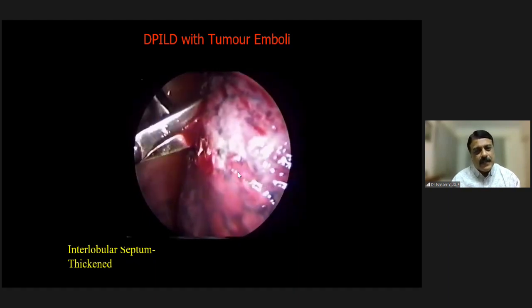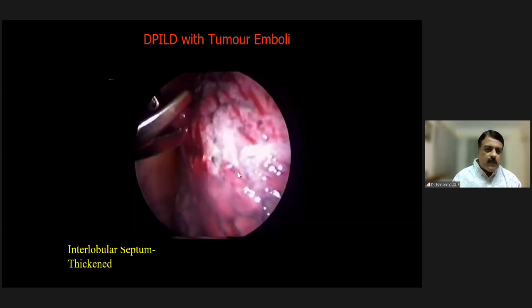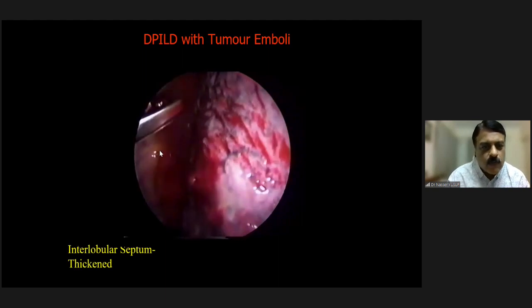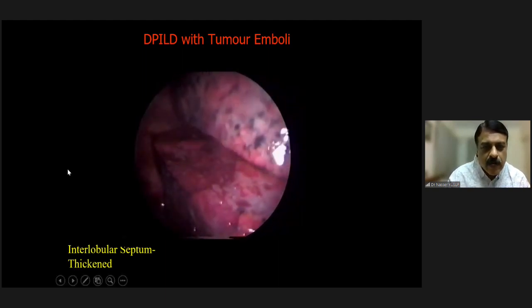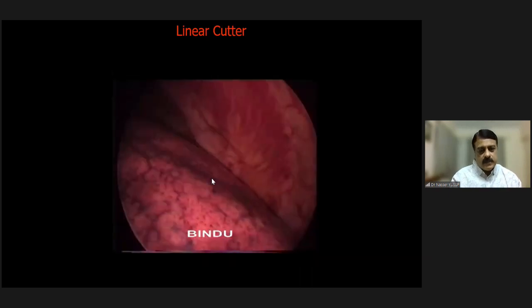But here, if there's a complication of a leak or bleed, we can deal with it. We normally cauterize and come off. I wouldn't recommend this. I no longer do it. What we do now is much more, I would say, pleasing to the eye, sane, and using staplers.